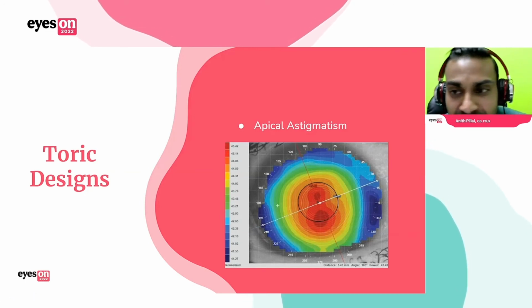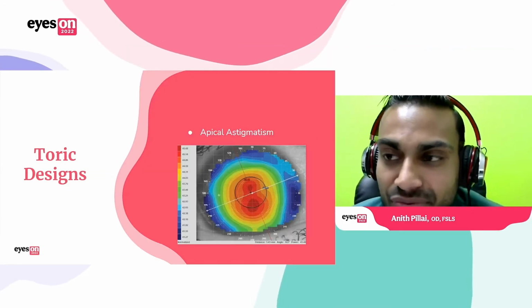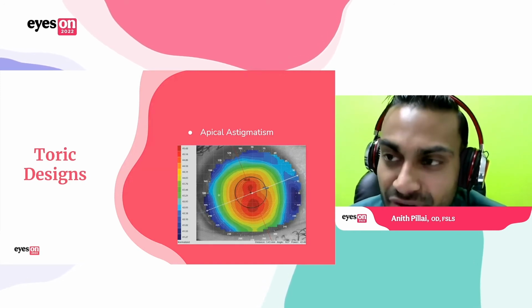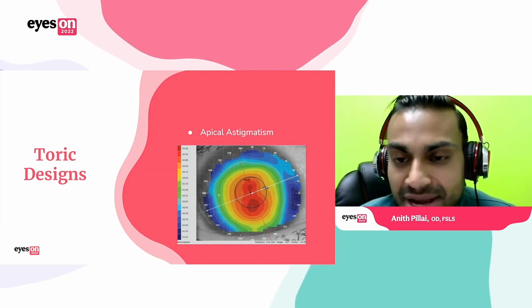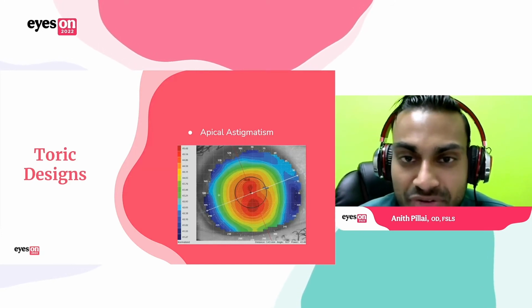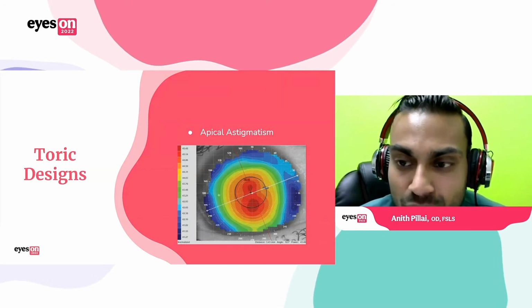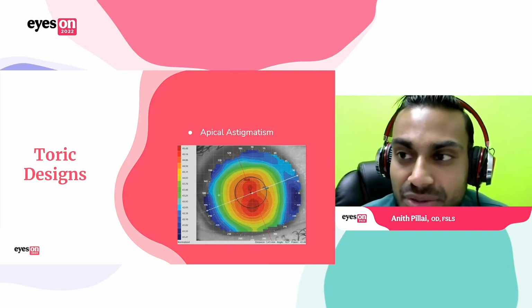Remember, when you're going spherical or toric in Ortho-K, it's like scleral lenses. It's not a refractive issue. This is the cornea toric or spherical. So you're fitting what the eye looks like. So you could have -1.50 refractive cylinder. That's not what's going to dictate whether you're picking a toric design or not. It's going to depend on that elevation difference. Is the cornea itself toric?